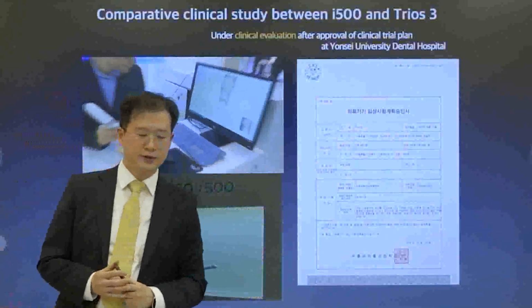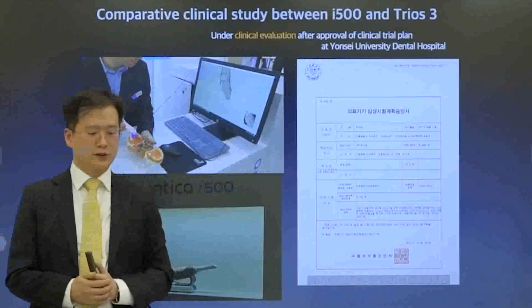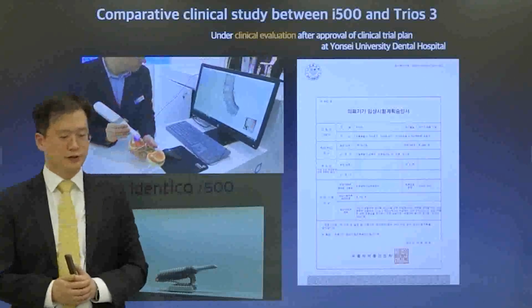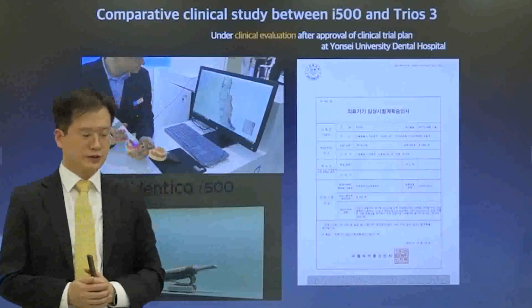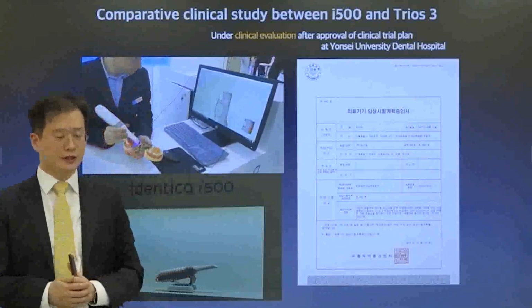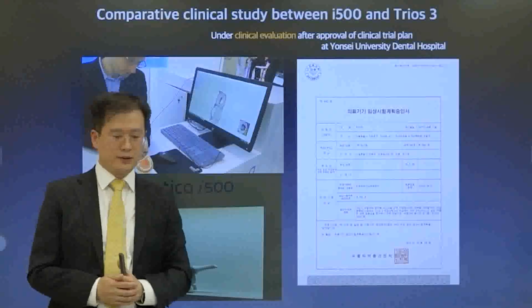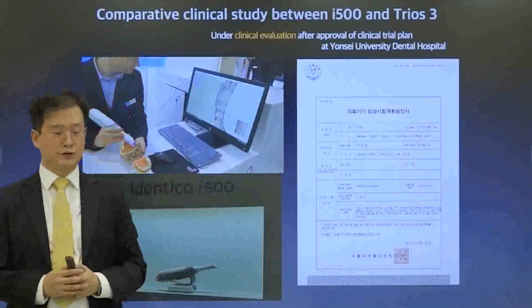I am authorized to conduct clinical trials from KFDA for a Korean-made intraoral scanner and one of the best-selling intraoral scanners in the world. And I started the clinical evaluation of these devices.